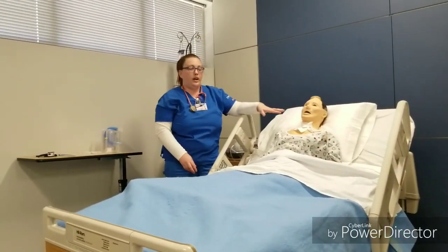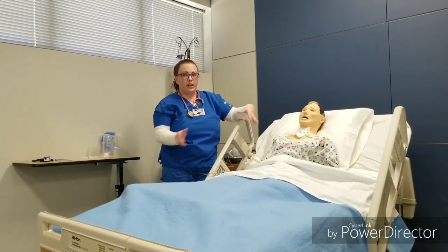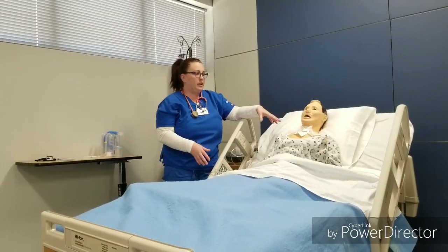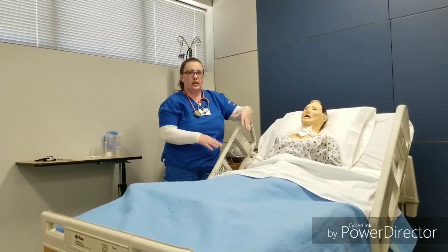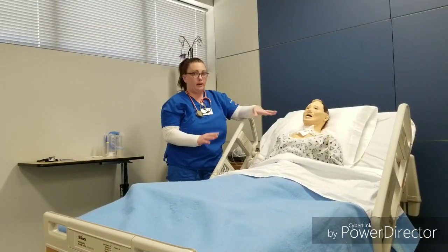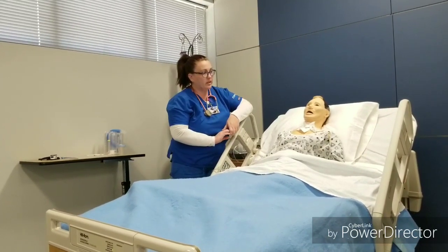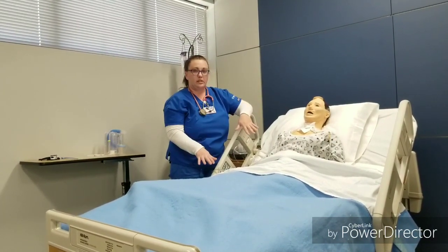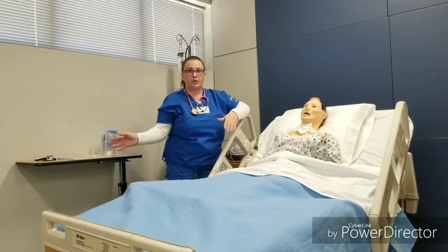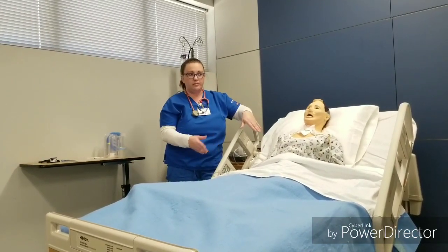And after you have placed your patient on this oxygen, in 30 minutes you need to come back and reassess the SpO2 reading, pulse, and make sure everything's good and your patient's not hyperventilating. And you would want to make sure the bed is at the lowest position before you leave the room, call light in place, everything within range.